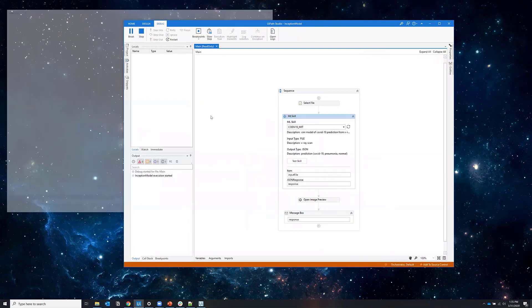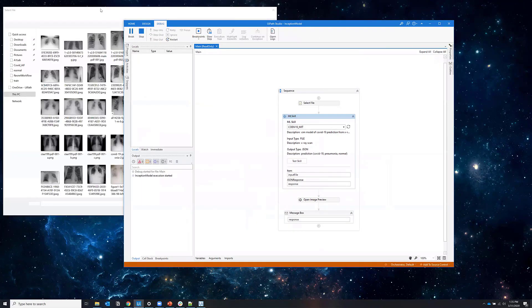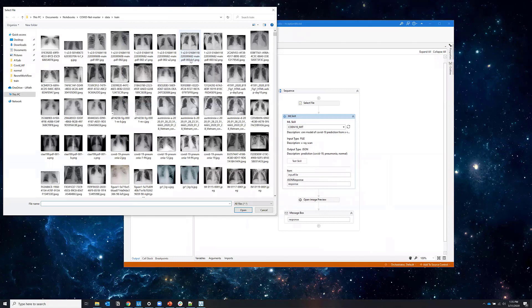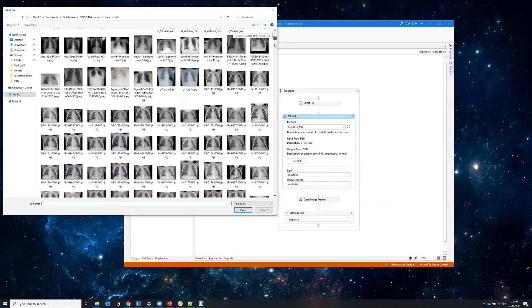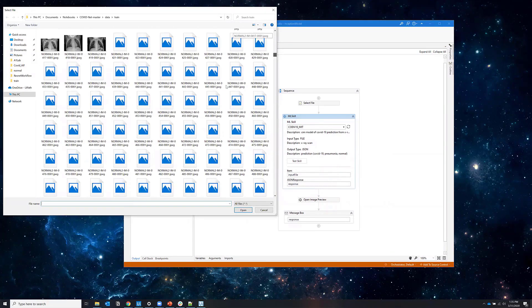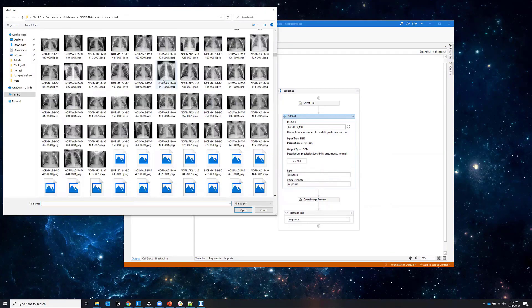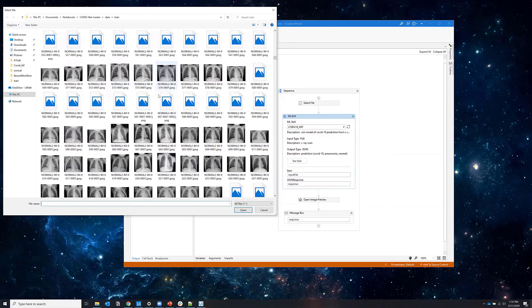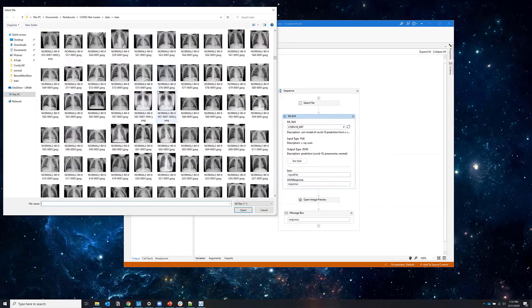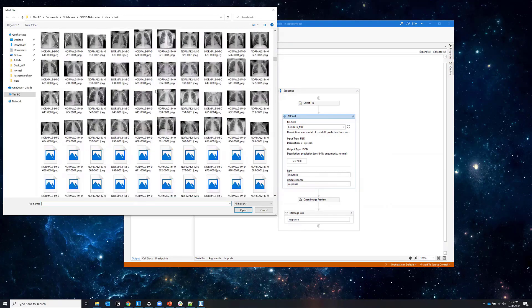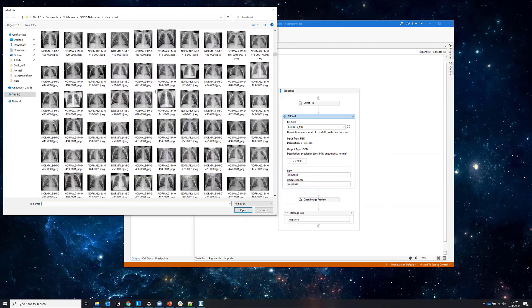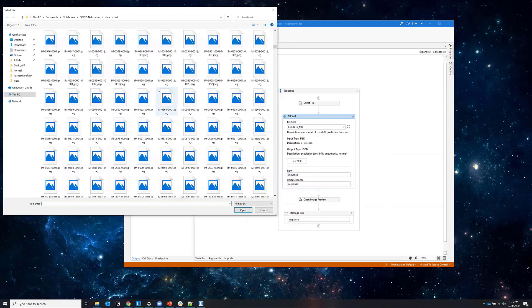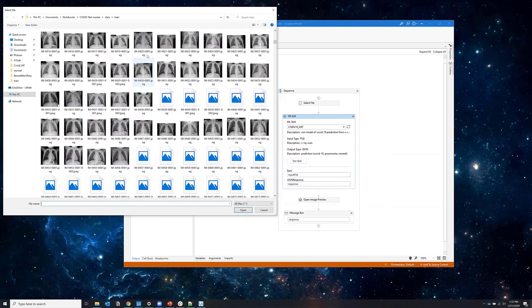So just starting the workflow, the robot asks me for such an image. Here I have all the data that was used to train the model from people with no disease, people with pneumonia, and people with COVID-19.